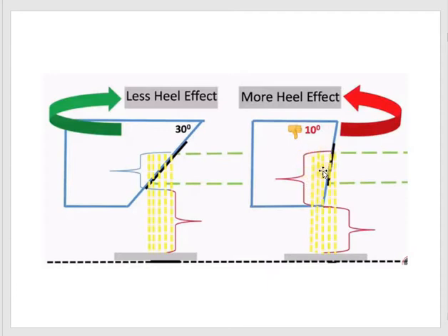That will significantly absorb the produced X-ray. So in short, photon beams, X-ray beams produced with an X-ray tube with smaller effective focal spot size will have a higher or greater anode heel effect. So I hope we get this right.